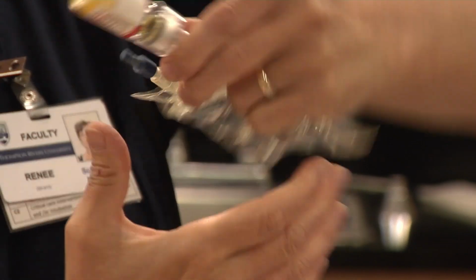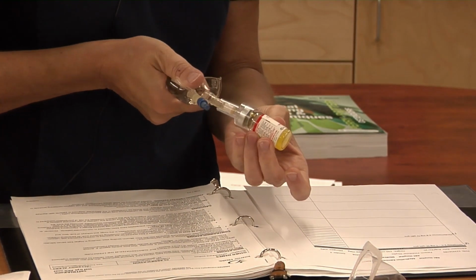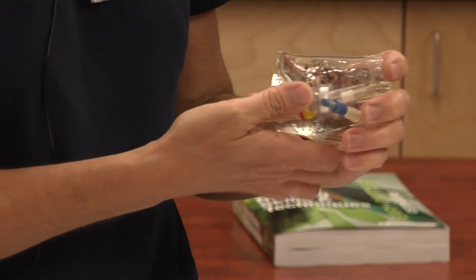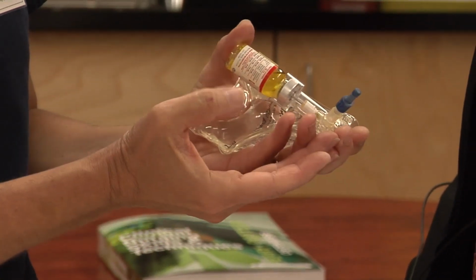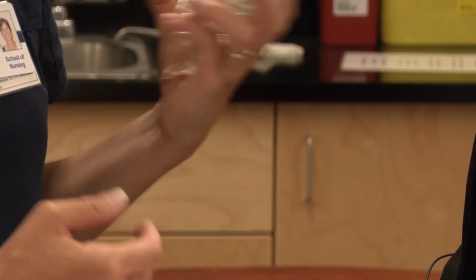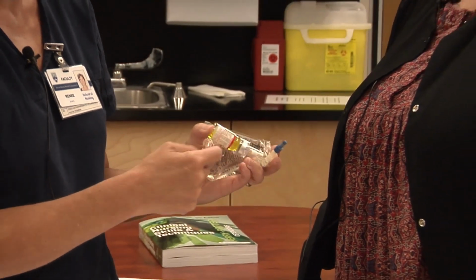All right. And then we simply are going to squeeze it. I don't know if you can see the powder is dissolving already. Some medications need a little bit of a shake. So I suggest fold it over, squeeze it this way so that the vial doesn't go flying off, and just gently shake it. There are some medications that are really hard to mix up, so sometimes you'll sit and shake for a couple minutes. Sometimes you'll put some diluent in here, like your normal saline, and just leave it sit there for 20 minutes, go do something else, and then come back and it'll be ready for you.